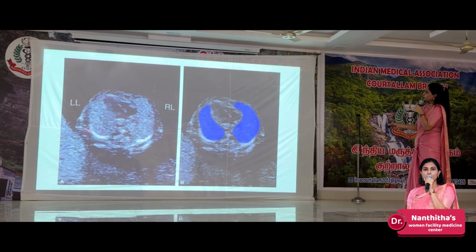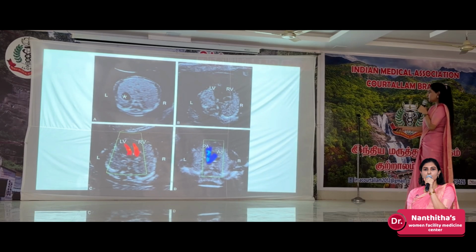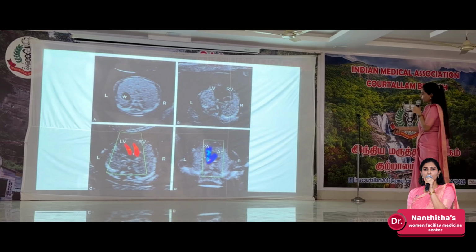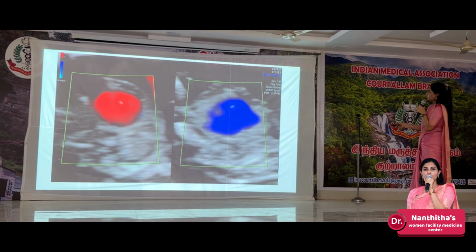Coming to the thorax, two echogenic lungs with a central heart. You can see these four images are enough for fetal thorax assessment. The stomach bubble and the heart apex should face the same side, and the two proper symmetrical inflow tracts and the outflow tracts, pulmonary artery and aorta, should converge to the left of the spine. These are some examples you can see.